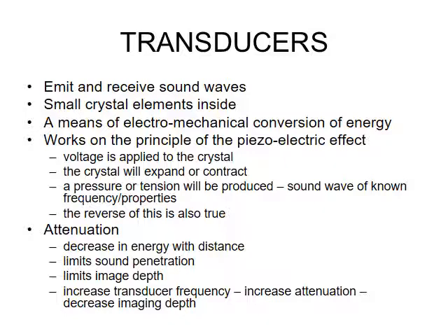And as I said, it's got tiny little crystals inside of it. Because of this, in physics, you've probably already heard of the piezoelectric effect. These crystals have this special property that allows them to expand and contract, and as they expand and contract, they give out a sound wave. Conversely, if we apply a sound wave to them, it'll cause them to expand and contract, and therefore we can read off a voltage. So it allows them to send out the sound and also to receive the echo that's coming back.